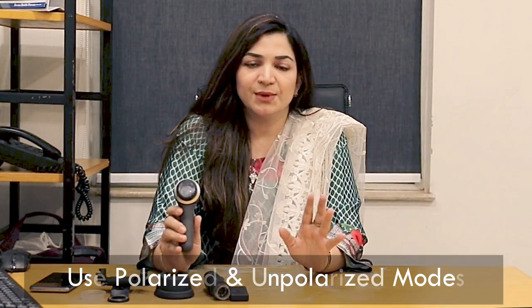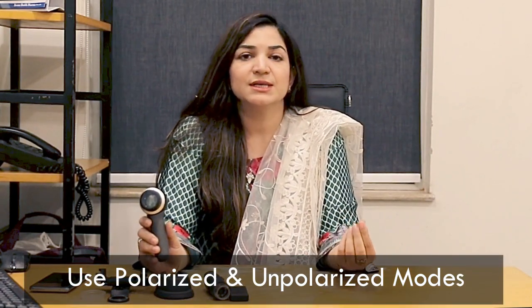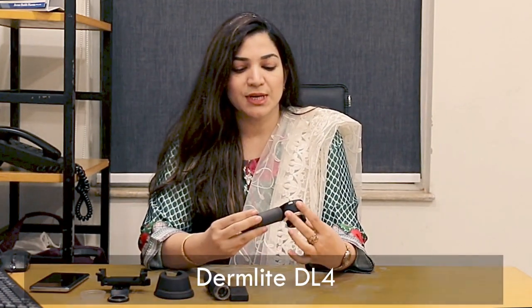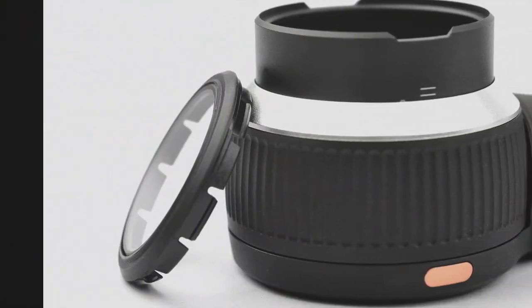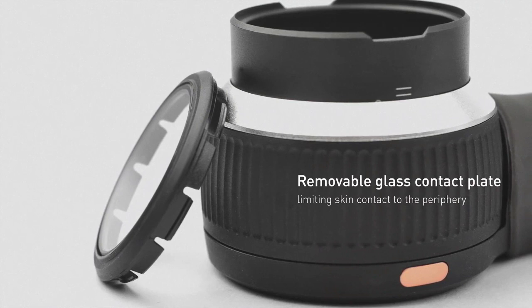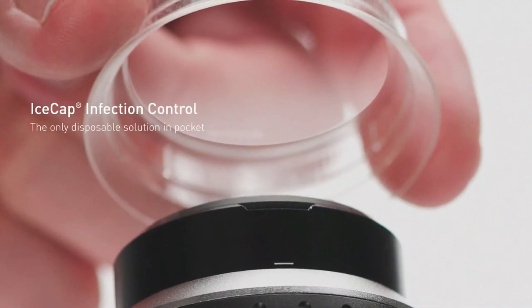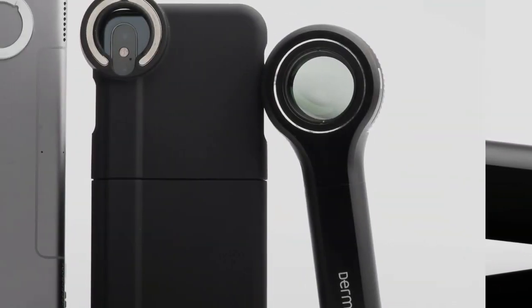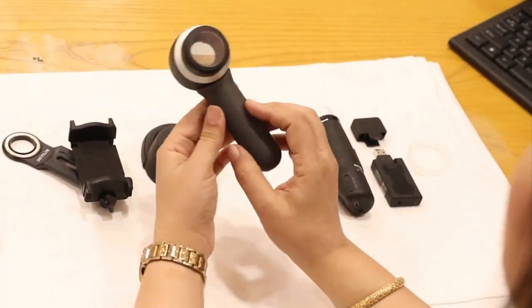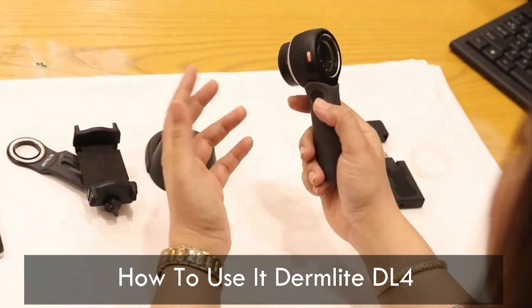These dermoscopes are pretty much good. You can use any instrument — the important thing is how to perform the test and how to interpret that image which you take with the dermoscopy. Today we will demonstrate this dermoscopy. This one is a DermLight DL4 dermoscopy. So let's now begin how to use this DermLight DL4.